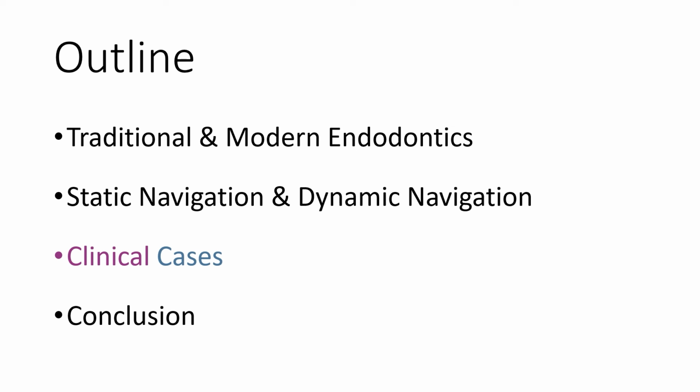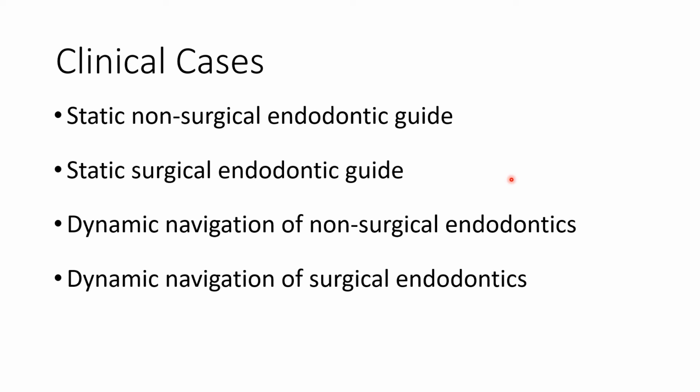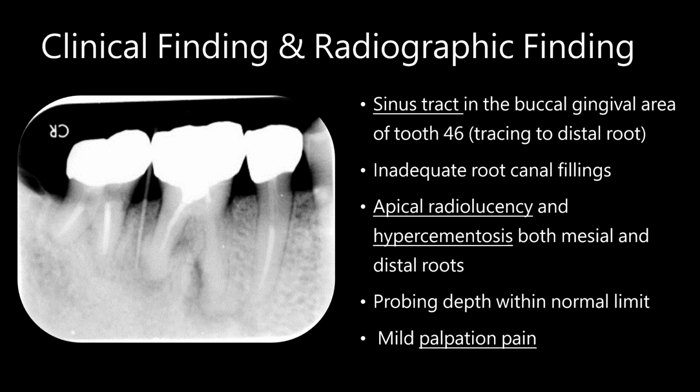So if you heard about all this, because we do not have a lot of time and you don't have the concept of this, we see the clinical cases. I have non-surgical with static guide, surgical with static guide, and non-surgical and surgical with dynamic, 4 cases. So let's see the static non-surgical first.